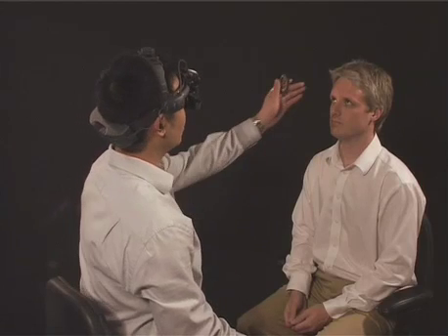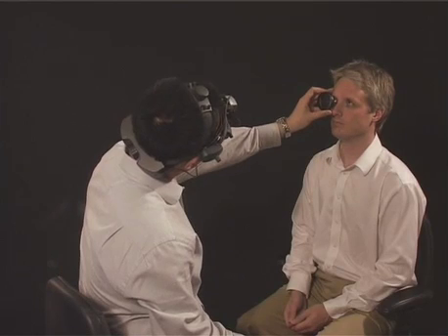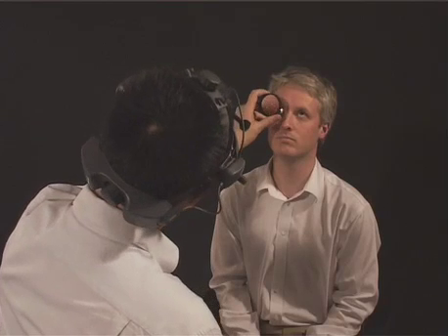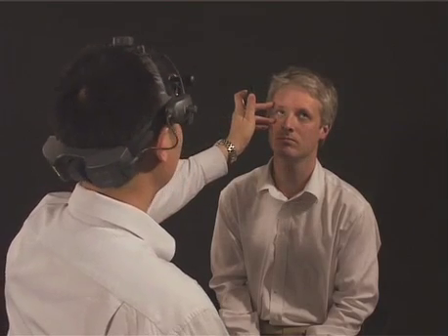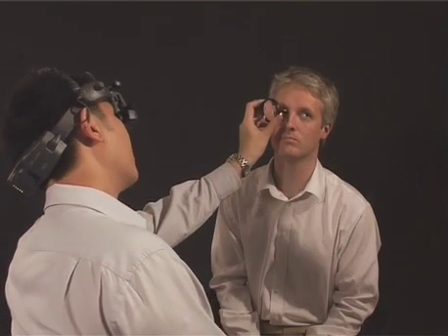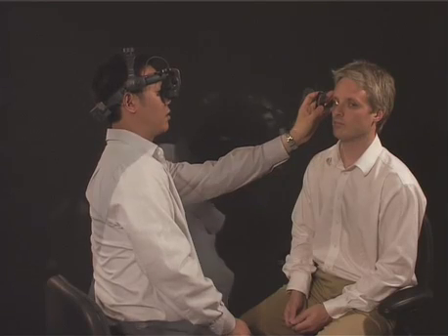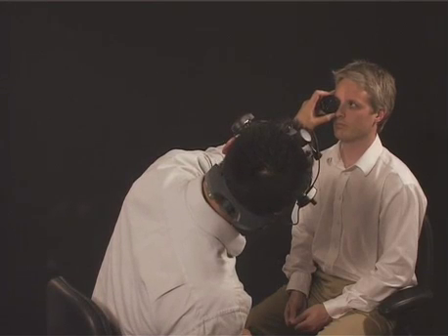An alternative to the supine position for examination is to simply have the patient seated on a chair with the examiner seated opposite. Although this is adequate for gross fundal examination, the use of scleral indentation to dynamically examine the extreme retinal periphery is very difficult. Consequently, the assessment of peripheral pathologies such as retinal tears or dialysis, although possible, is somewhat less reliable.